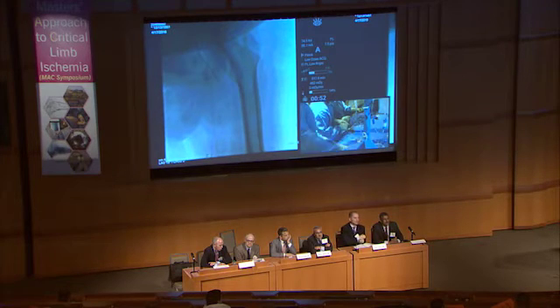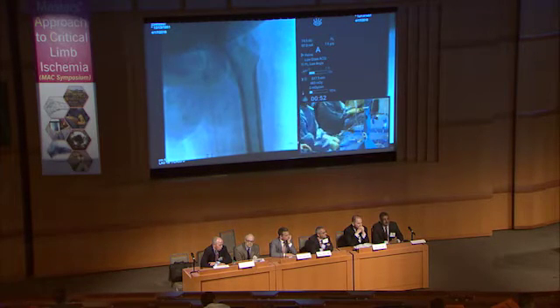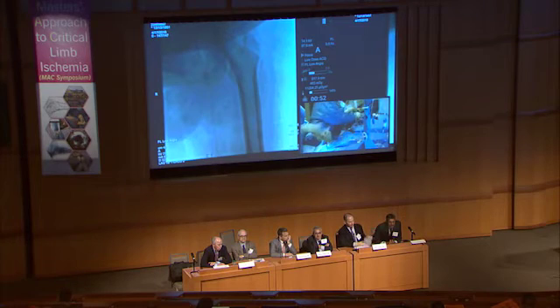I think this is very important in this case, because if you're talking about placing a Viabahn in someone who already has very poor outflow, because this patient has quite poor outflow, it's very important to try to figure out what you're doing. Great point. That was correct. So Mary, you heard that suggestion from Dr. Walker too? It's a great suggestion. And that is a good point.